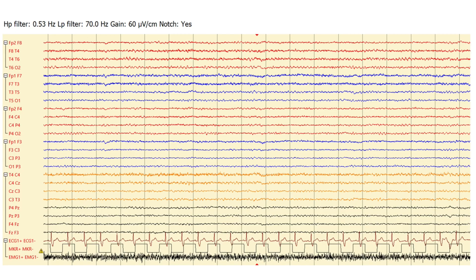One of my favourite things that I do when I start looking at an EEG is to try and work out the age of the subject. This is a lovely trace over here, and you can see a couple of different things. We've talked about what the alpha rhythm looks like in other videos, but over here you can see an alpha rhythm of about 8 hertz or so, with a couple of underlying slow waves every so often in the posterior regions. I would roughly age this at about 65 to 70. We'll come back to this a bit later on.